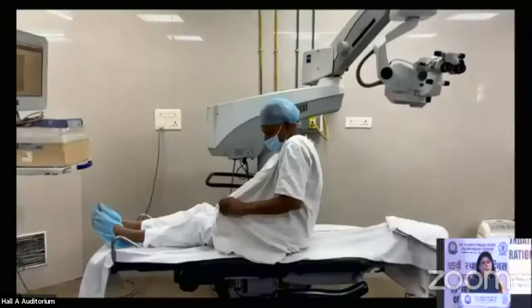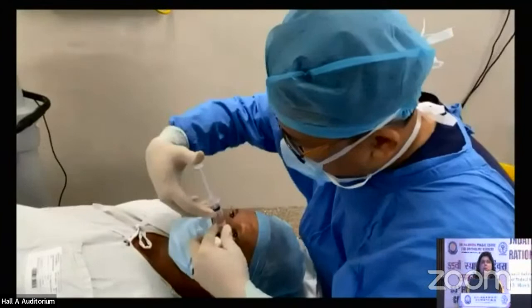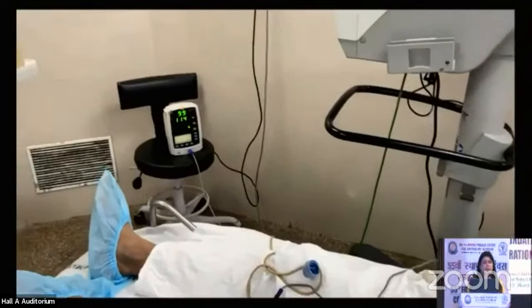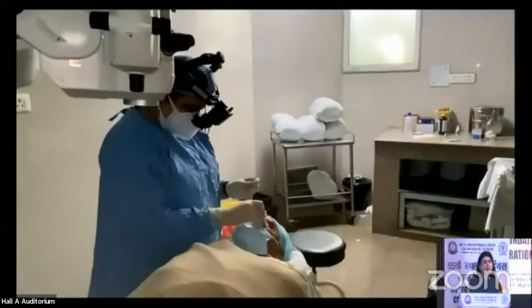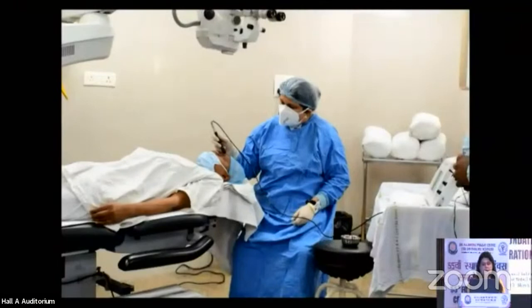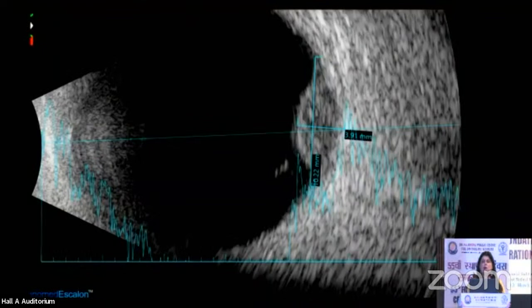Now, at this point in time, we always like to make the patient comfortable. Here, this is a choroidal melanoma. It can be done under local anesthesia, but when it is a case of retinoblastoma, obviously we need help of the general anesthesia. So that's how the patient is prepared. Before the surgery starts, we confirm by doing an indirect ophthalmoscopy, make sure we have the tumor dimensions correctly. And once the indirect ophthalmoscopy is done, we also confirm with an ultrasonography, a B scan, and you have already seen the images of the B scan showing a dome-shaped choroidal mass with the thickness.